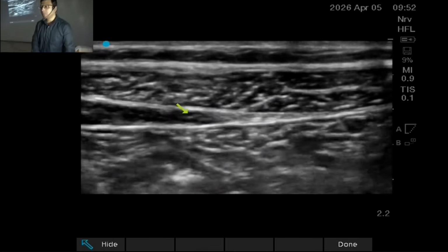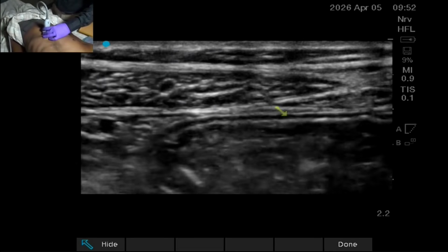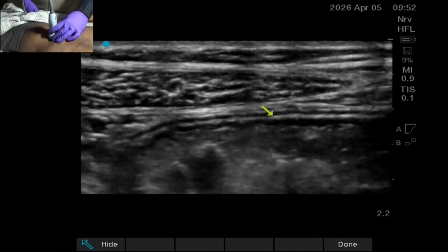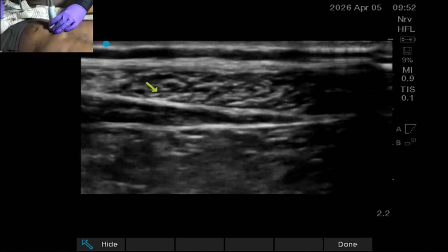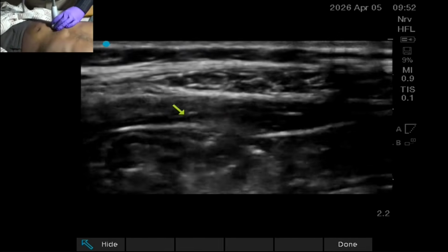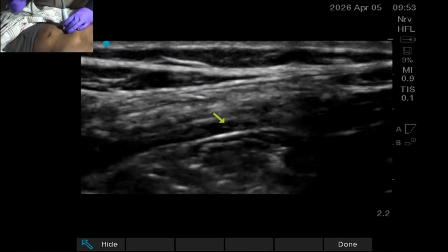If I move on laterally, this was the midline we have seen. The moving, shiny structure is the peritoneum. This hypoechoic space you are seeing is the pre-peritoneal space. Now if we move on laterally, can you see one more muscle coming into the picture? What is that muscle? Okay, very good. I am moving further laterally. Can you see three layers of muscle now?